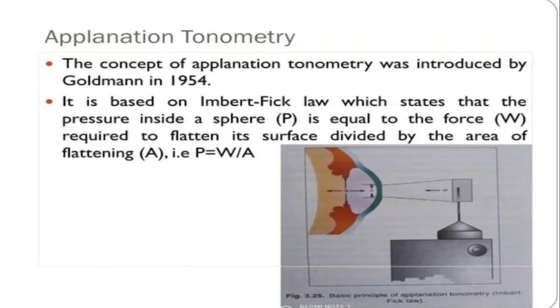Applanation tonometry is also used to monitor IOP in patients who have had ocular surgery or who are taking medication that can affect IOP.